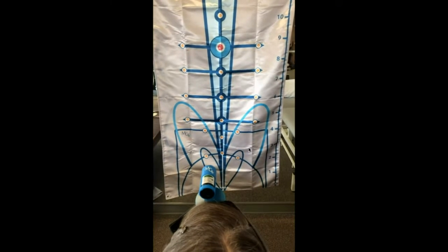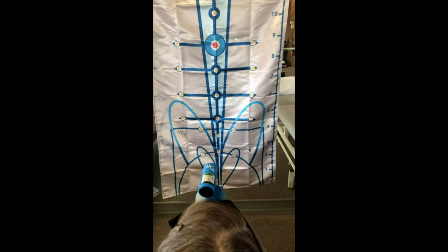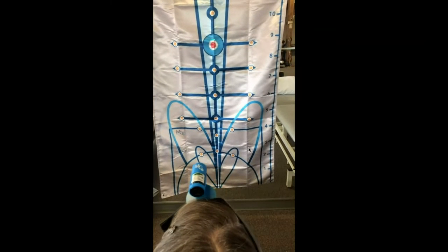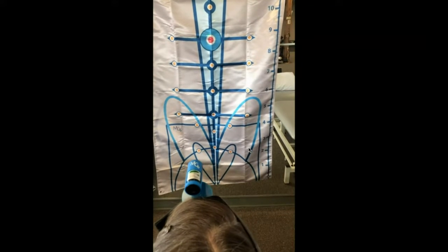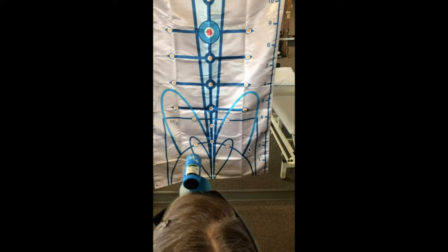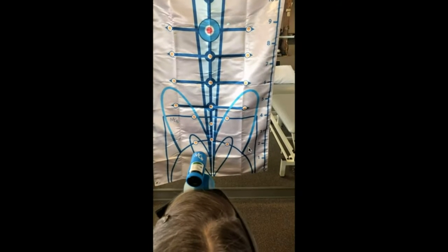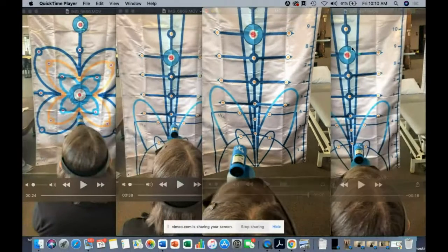And she just does not like it, but she's definitely learning that she has to go to that right side. She just can't go to the left side with the laser. She has to go back and forth. And so this is a form of improvement for us just by recognition that she has to go to that right side when she's doing her VOR. Okay, she just can't dominate to the left side turn.